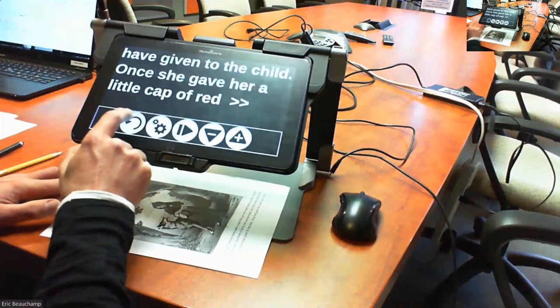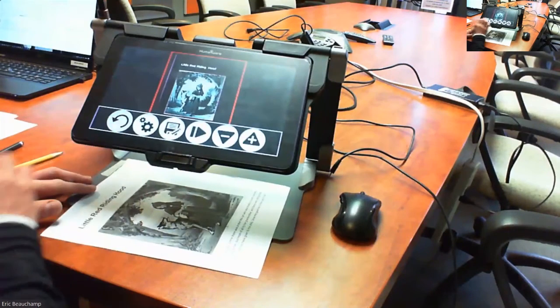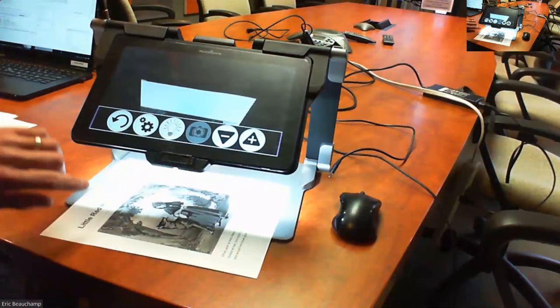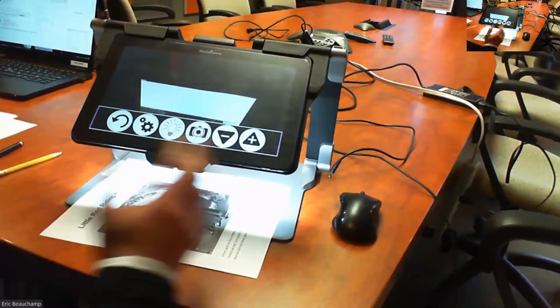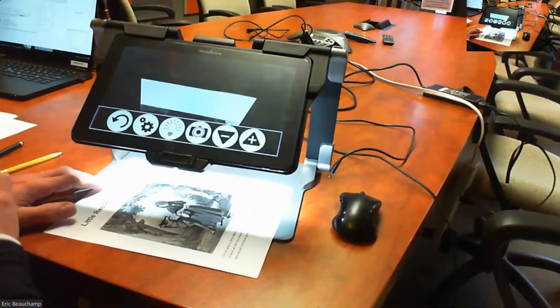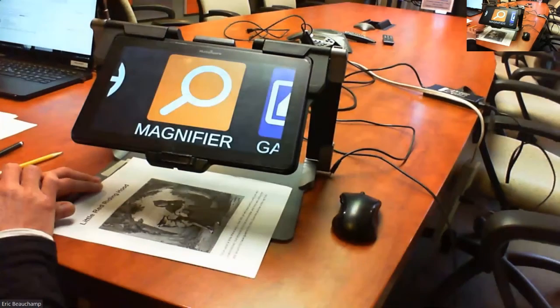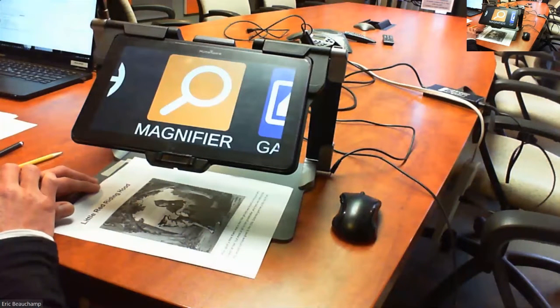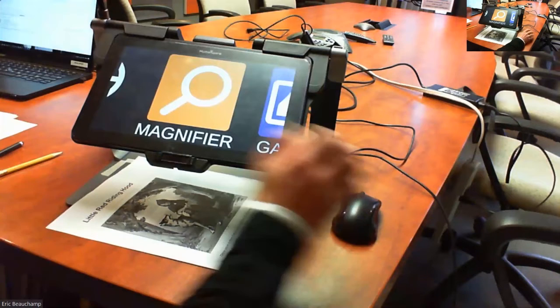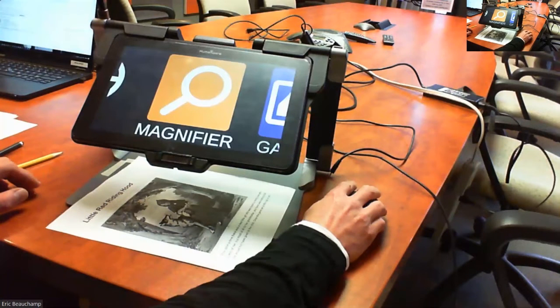So we did an OCR. Let's go back. We did some manual tasks, some writing under the camera, and we deactivated the autofocus to help us with the focus. Now let's say the teacher says, please look at the map that I have in the front. I have a map here of the US, and what I want to do is see the map at a distance.